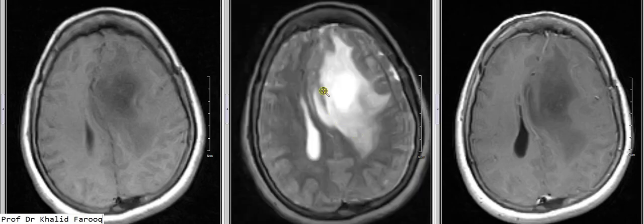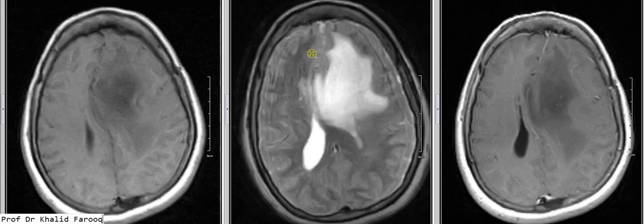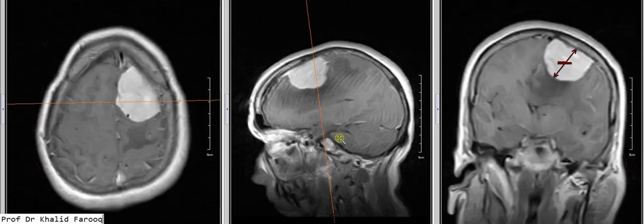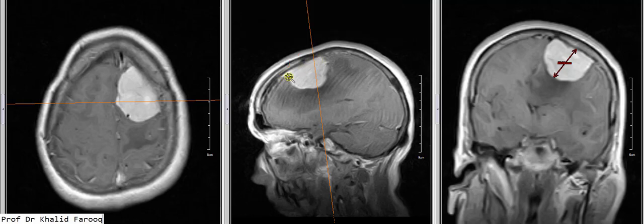Here we can see axial, sagittal, and coronal post-contrast images. We can clearly say that this is an extra-axial mass which is meningeal-based, and dural tail sign is also noted in the sagittal image. This is an example of meningioma. Thank you very much. Assalamualaikum warahmatullahi.